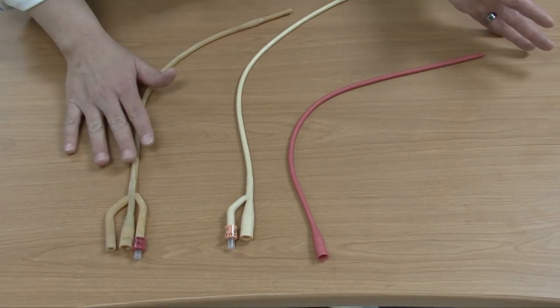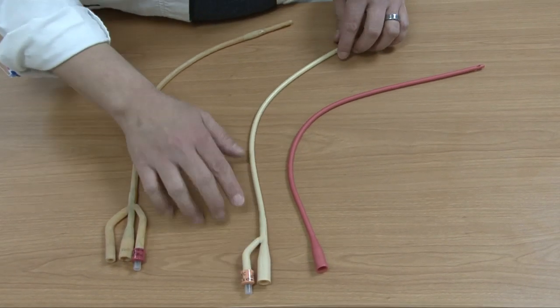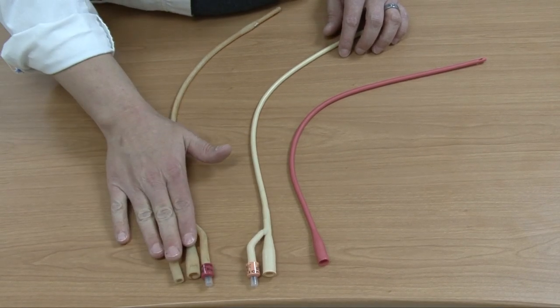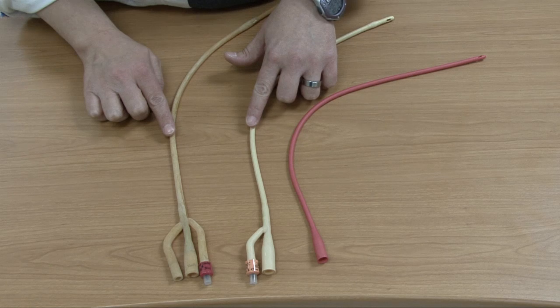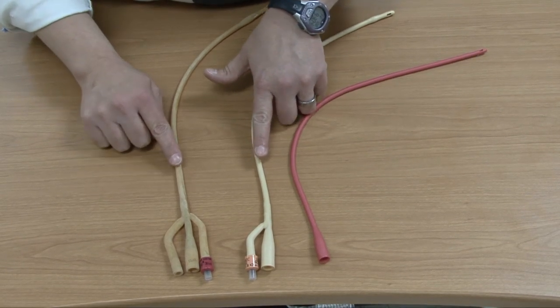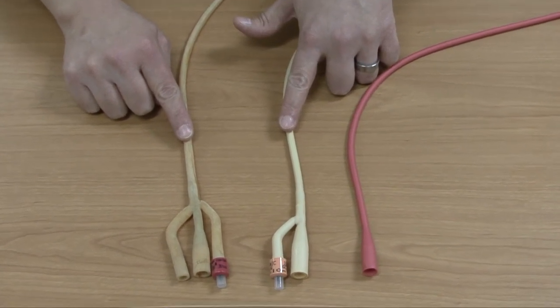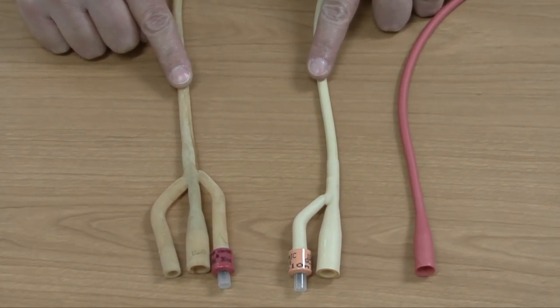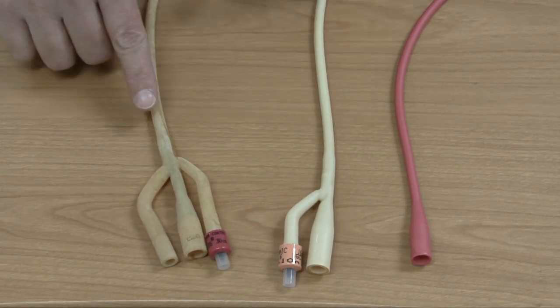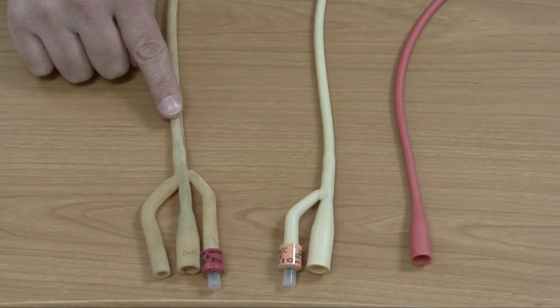Another thing to note is the size of the catheters. This one is a 16 French and this one is an 18 French. The 18 French is larger than the 16 French. With catheters, just like with NG tubes, they follow the French system — the smaller the number, the smaller the catheter. Thus the 16 French is going to be smaller than the 18 French.